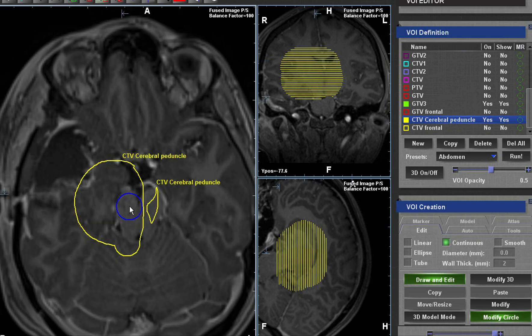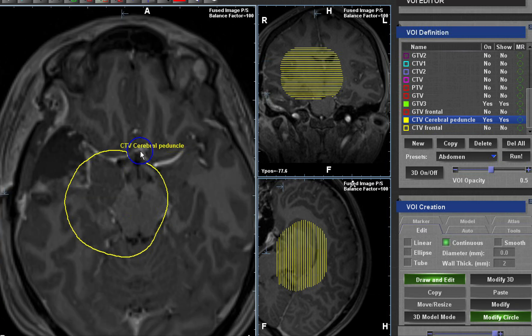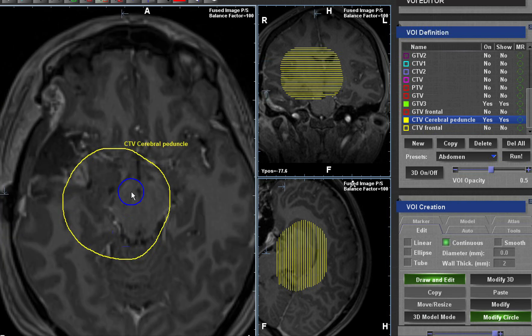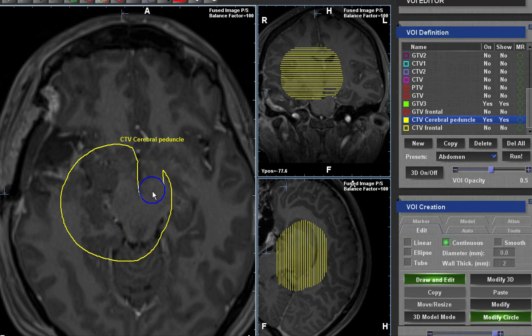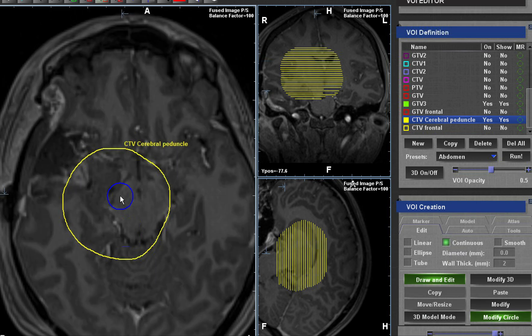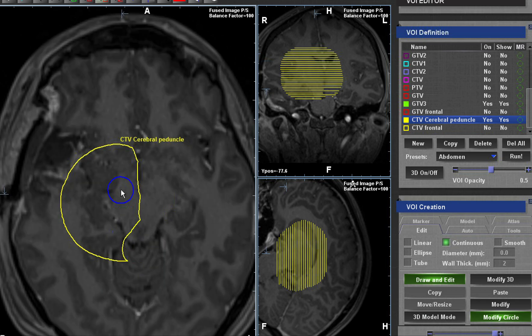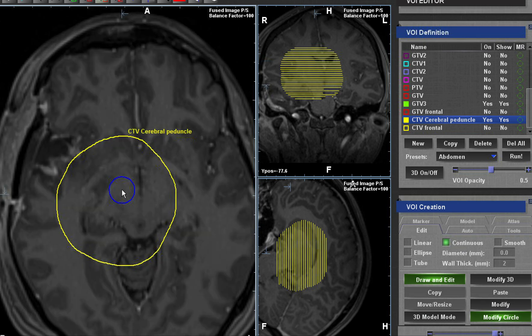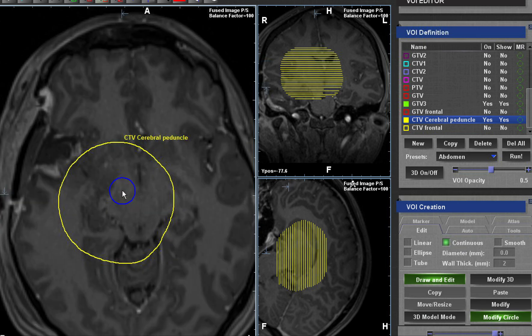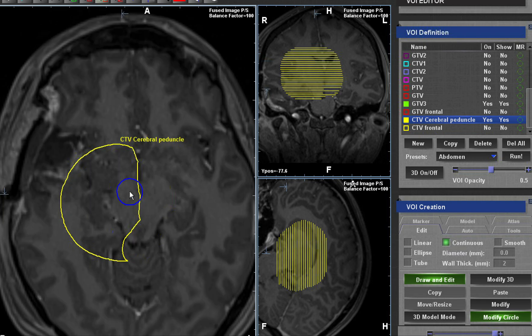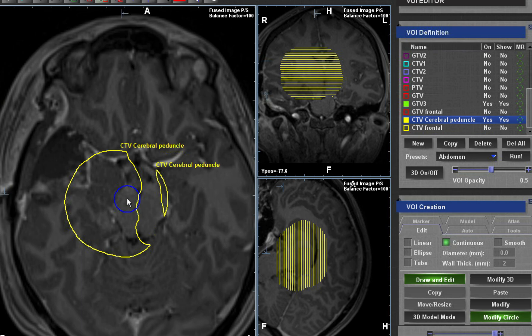The question becomes: how much dose should you give to the cerebral peduncle? If you have a genuine fear of disease there, you can give full dose. If you suspect only microscopic disease, you can give up to 54 Gy. If the thalamic disease is very close to the cerebral peduncle, I take it to full dose and explain it carefully to the patient. Alternatively, you can stop at 54 Gy and ask the physicist to plan accordingly.